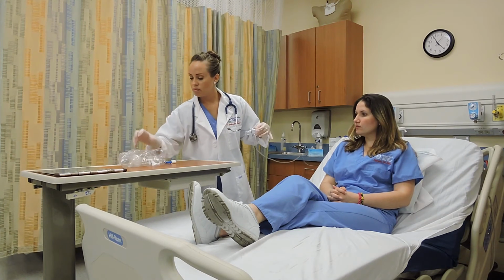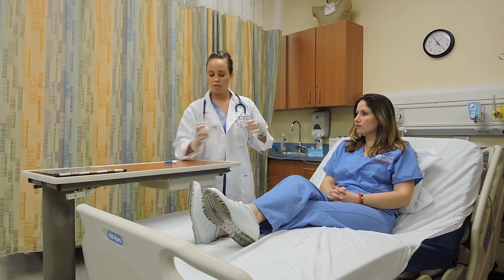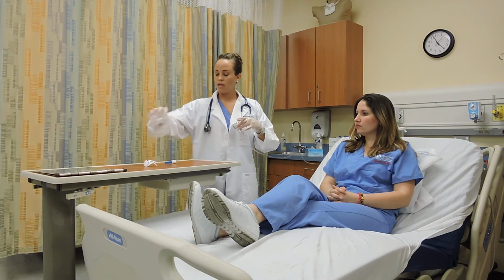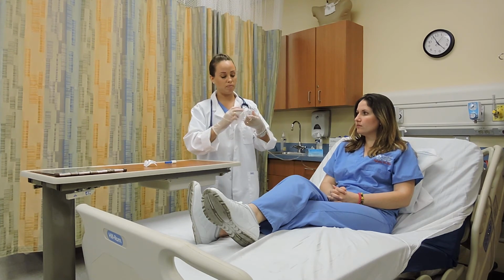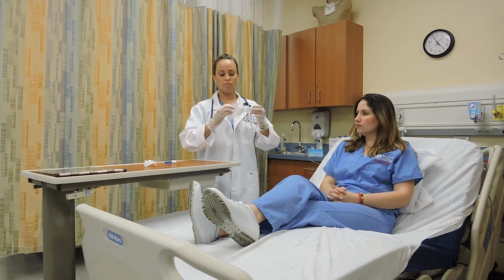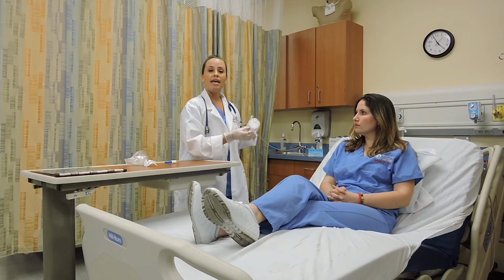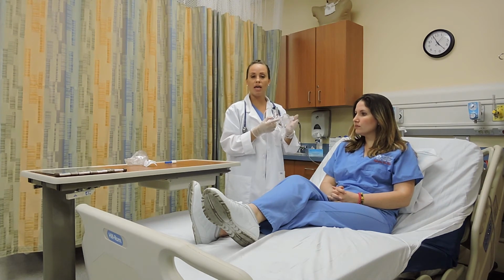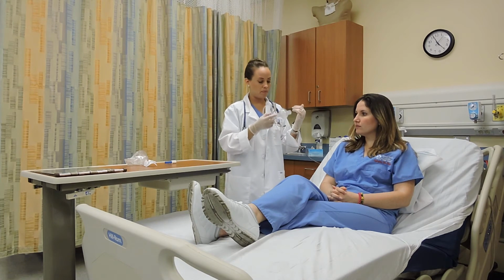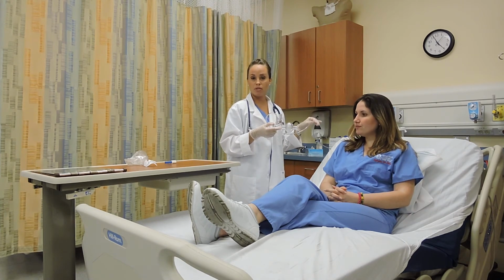Then I'm gonna attach the mouthpiece. And then I'm gonna go ahead and instruct my patient how to use the equipment and how to go through the therapy. First thing I'm going to do is to position my patient in the correct position.